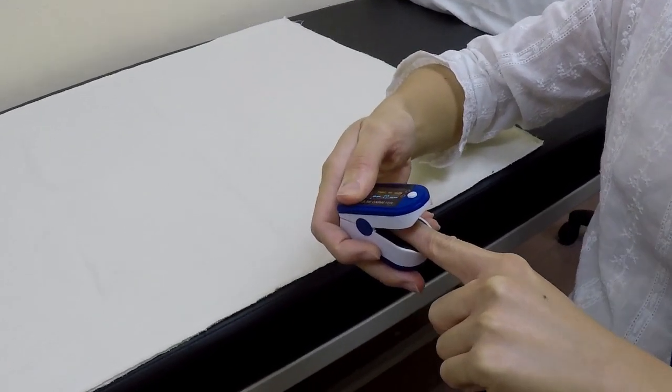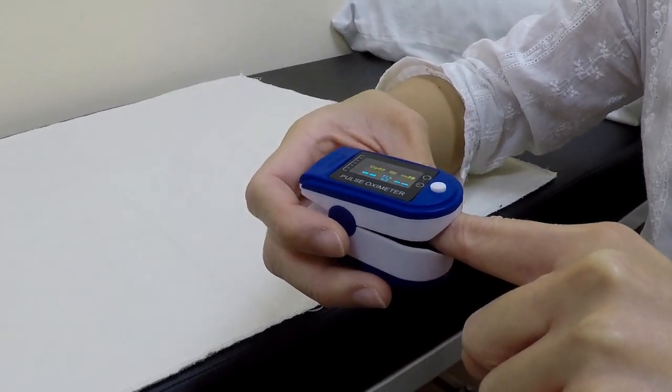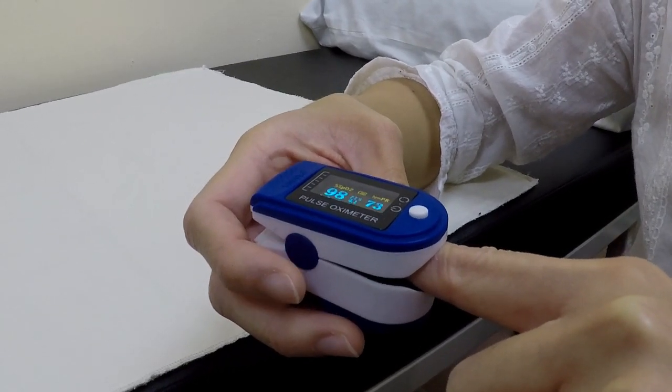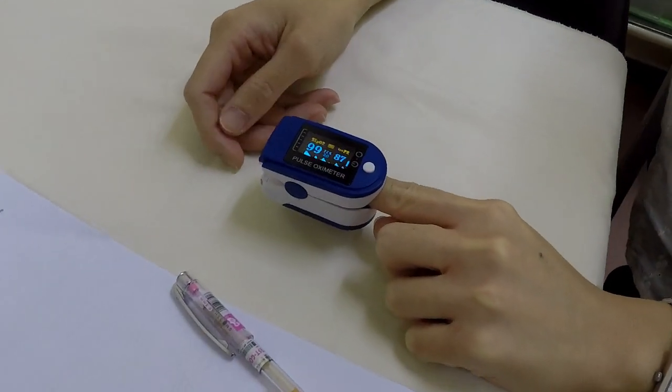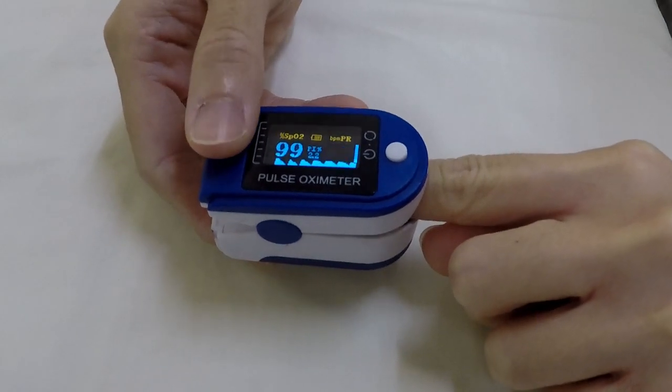Place the device on your index or middle finger. Keep the device in place for at least 1 minute to have a steady reading. Write down the highest result shown once it has not changed for 5 seconds.